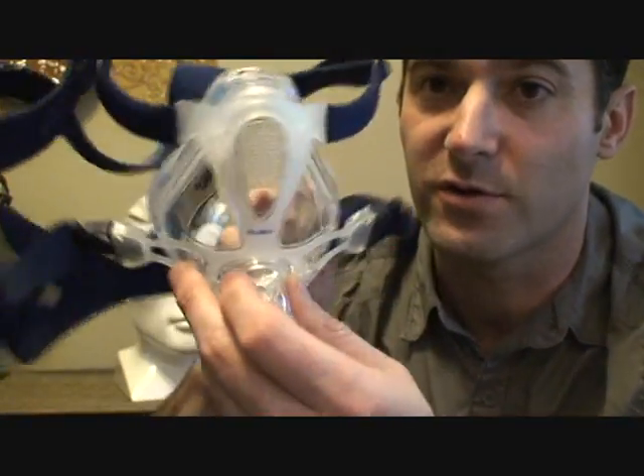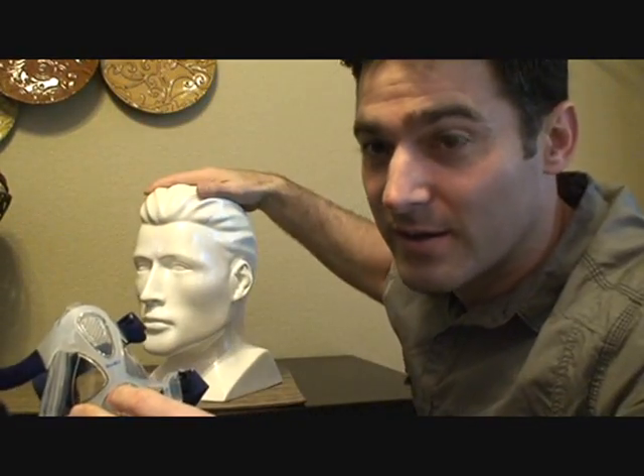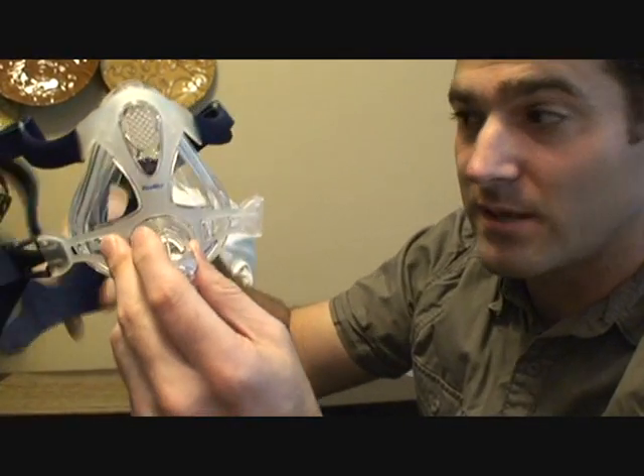First things first — it comes out of the package like this, so you should be able to know how to put it on right now. We'll show you how. Here's the headgear, so undo one side — just unclip one side.